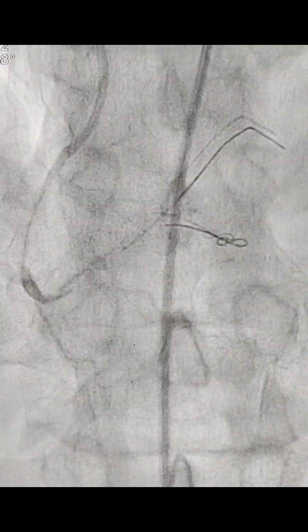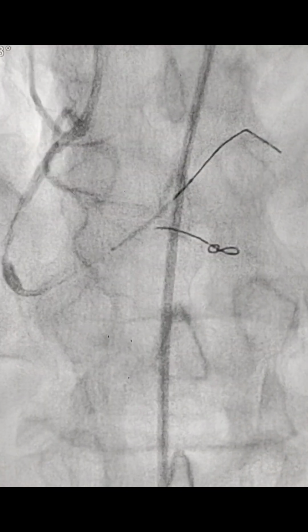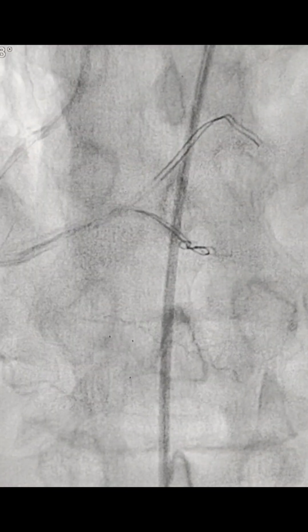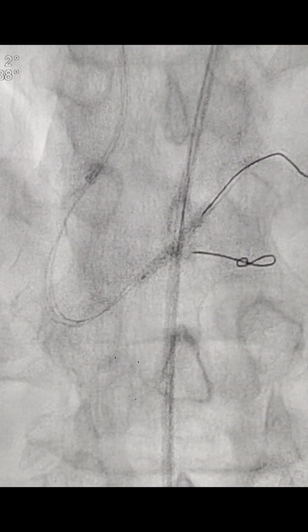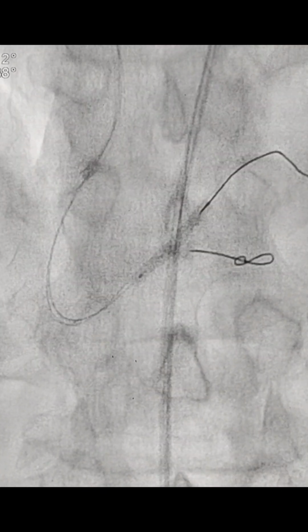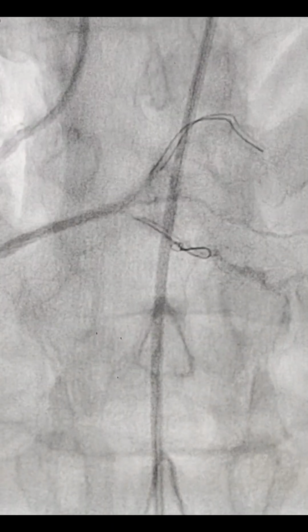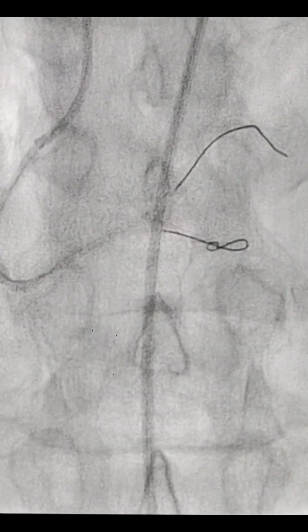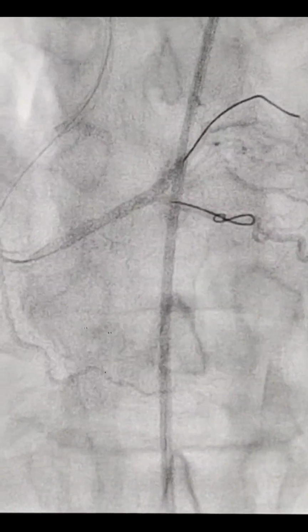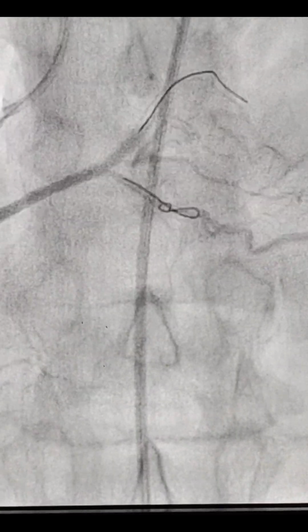So one wire was in the PDA because all the LAD is getting filled from the PDA, so my concern was it should not get closed, so I was very careful. And then this was the stent deployment at 12 atmospheric pressure. It was nominal. This is a picture after the stenting, after the angioplasty in the RCA PLV. There's no pinching of the PDA, and then we did the POT.